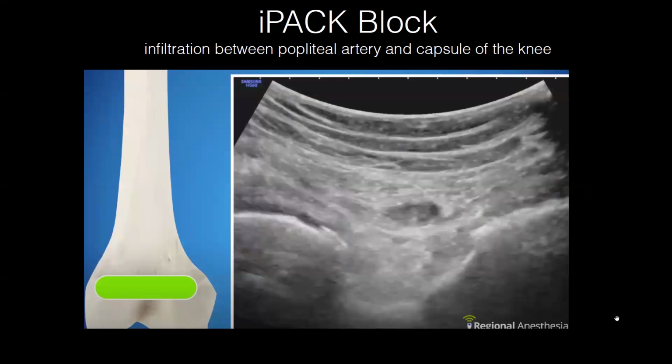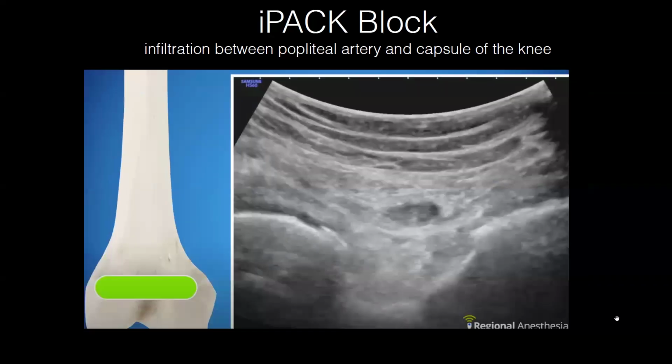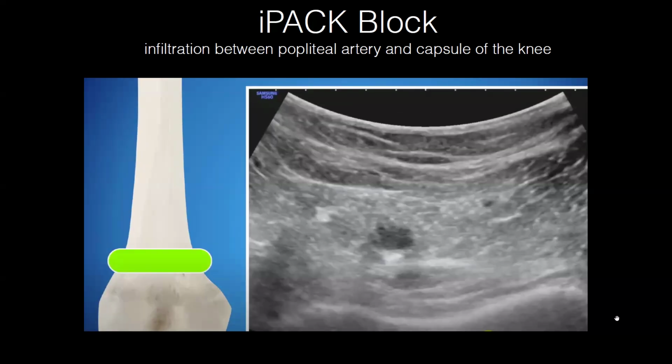And when you're distal, you see these 2 condyles. So you start there. Okay, that's my condyles. And then you move proximal until you see it more straight. You see the difference there between condyles and straight? That's the metaphysis. You get diaphysis, metaphysis, condyles. So this is the metaphysis. You don't want to be where it's circular, the diaphysis. You want to be where it's metaphysis. And then our needle will come in between the bone and the vessels. So it's just important to see the vessels, to see the bone, and go between there and inject 10 mLs of 0.2 Ropi on the way out.